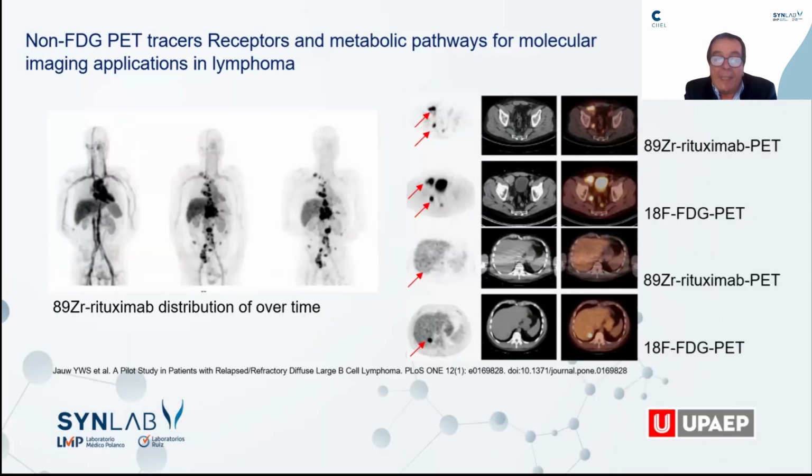Another new tracer under development is those tracers that target the CD antigens, like rituximab, that's a zirconium-marked new radiotracer that labels the CD20 receptor.